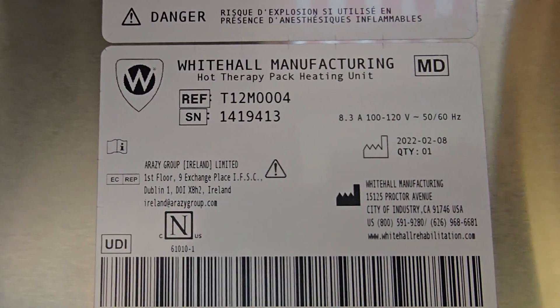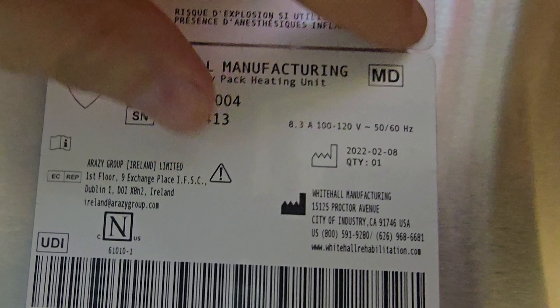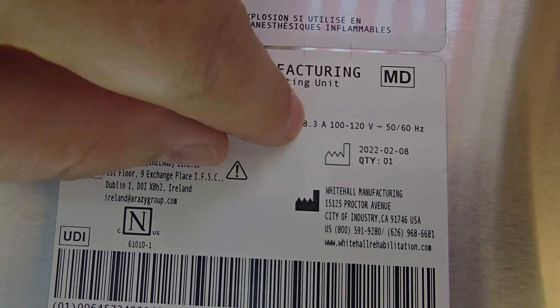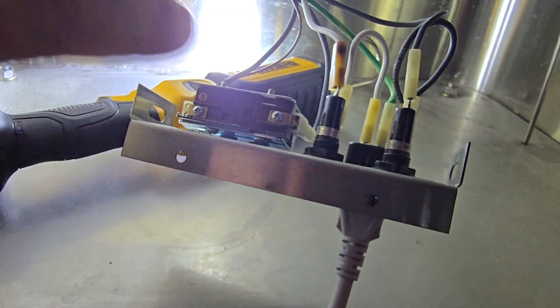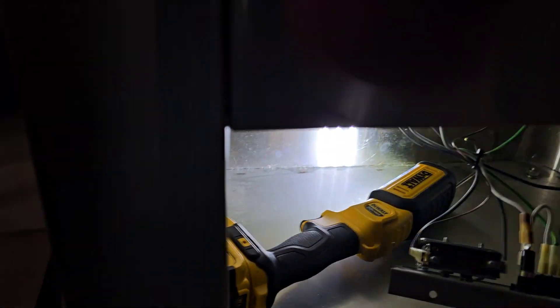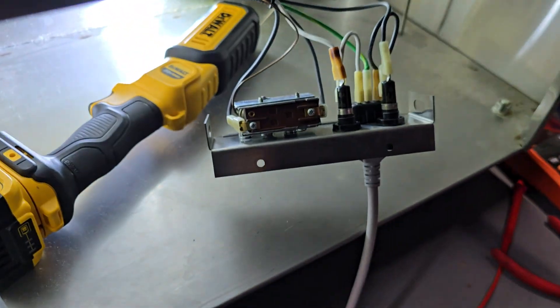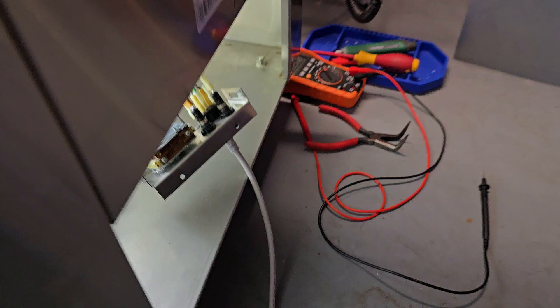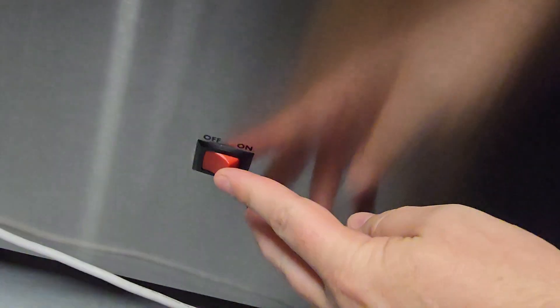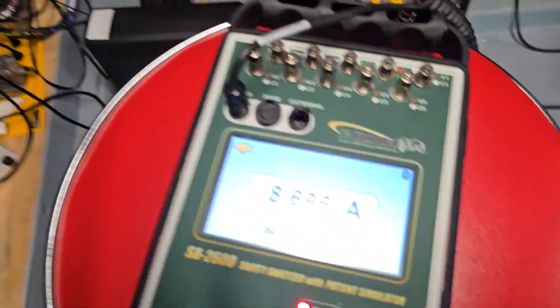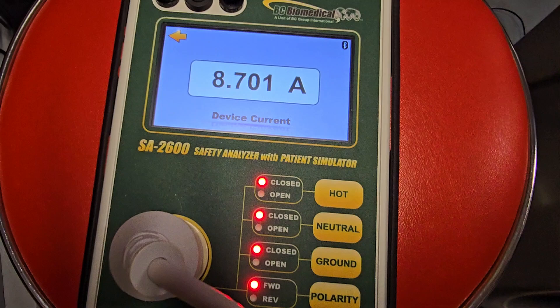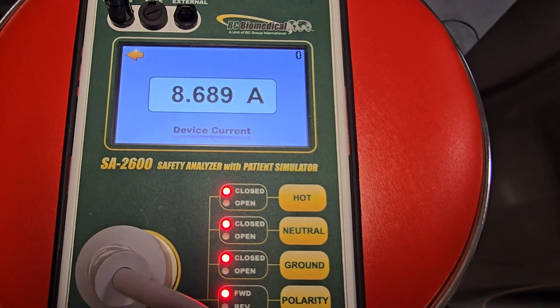But anyway this guy right here it says that it pulls 8.3 amps. So I reset the thermal fuse, the plunger is reset, down here I have AC mains plugged back in. I have checked the fuses and they're both good. So now let's check we have lights and remember it was eight point something amps.